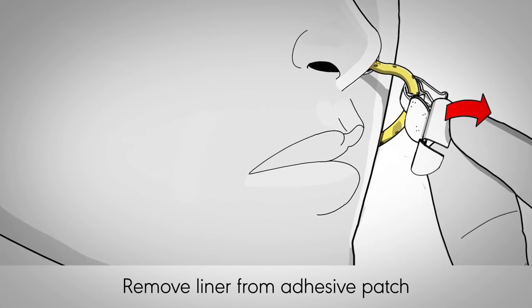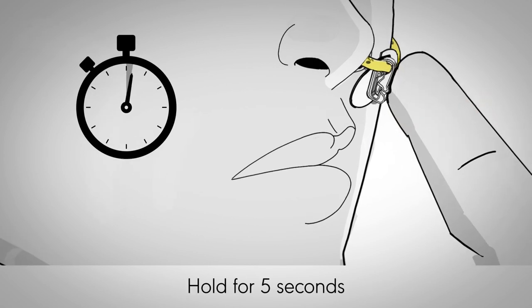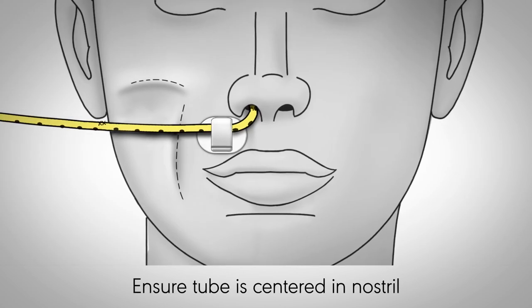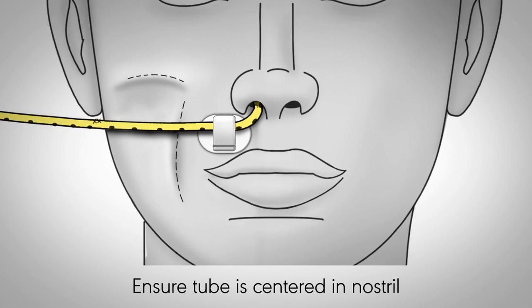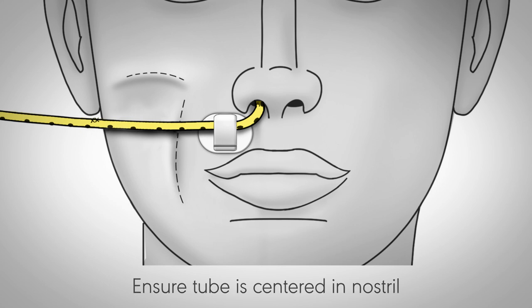Carefully remove the liner from the back of the adhesive patch. Hold the anchor on the skin for at least 5 seconds to adhere the anchor to the skin. To reduce the risk of pressure injury, position the device such that the feeding tube is centered in the nostril, not pressing on the side of the nose or septum, and avoid placement on bony prominences.